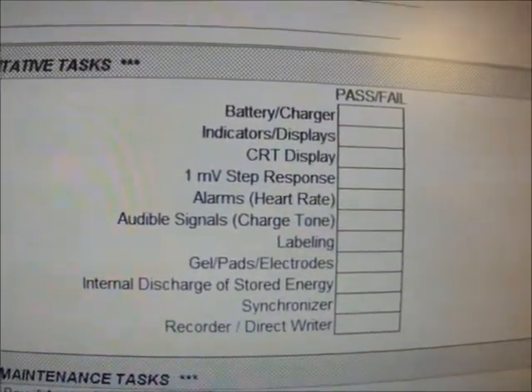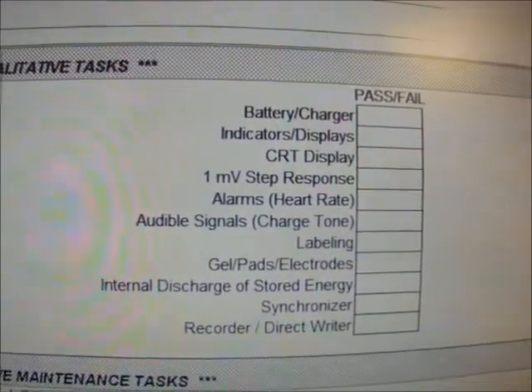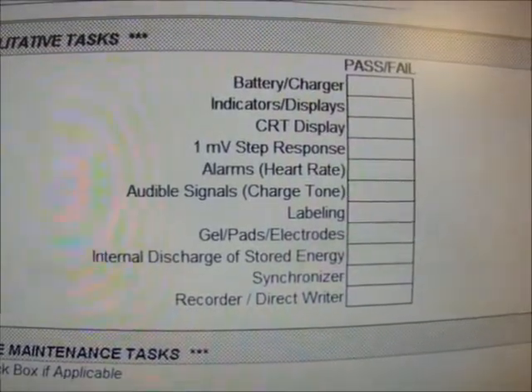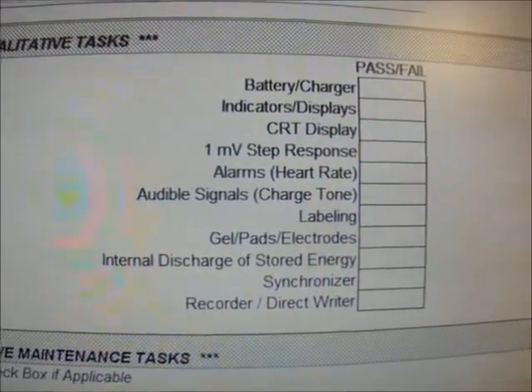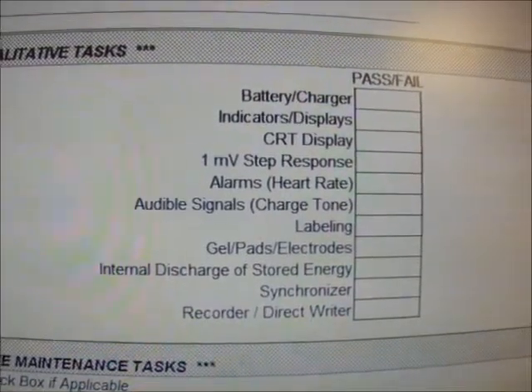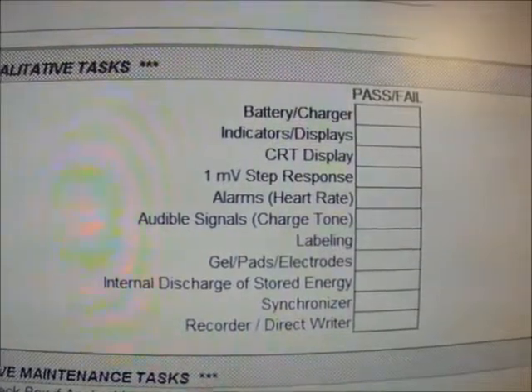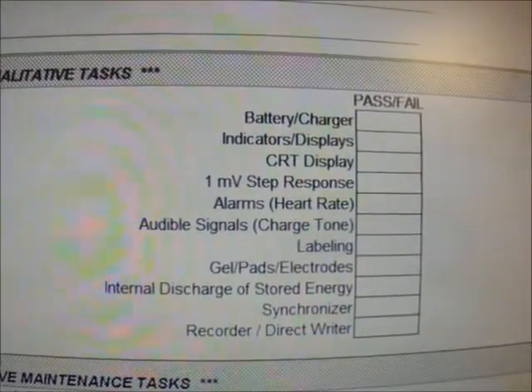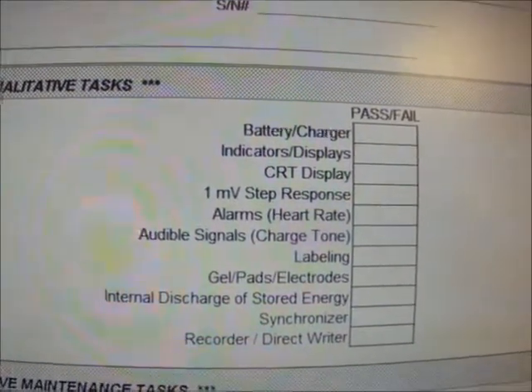We also look at the indicators, the CRT display, the 1 millivolt step response — which is the diagnostic square wave — and heart rate alarms. We will verify the proper operation of alarm tones and flashing LEDs, and verify the operator's ability to suspend or silence the alarm for up to 90 seconds. We will also resolve any chronic problems, such as nuisance alarms — those that do not require the operator to take any action.